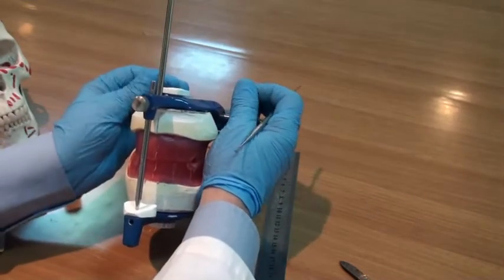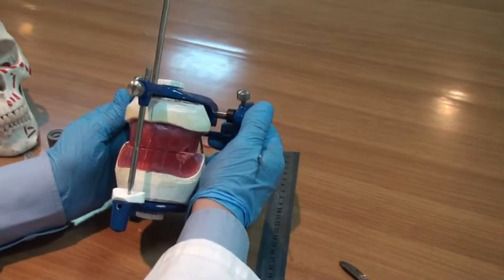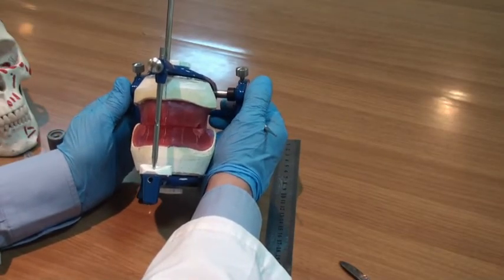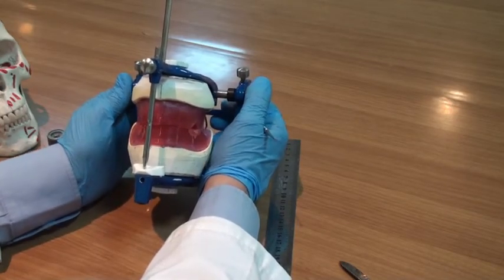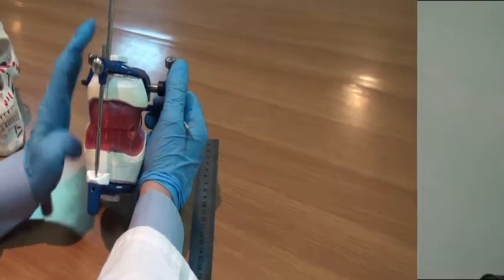Now, you can notice, open the centric stops, and we move in a protrusive movement and lateral movement. You can notice that the incisal pin does not separate from the incisal guidance table. The setting of teeth must not alter these paths of movement.